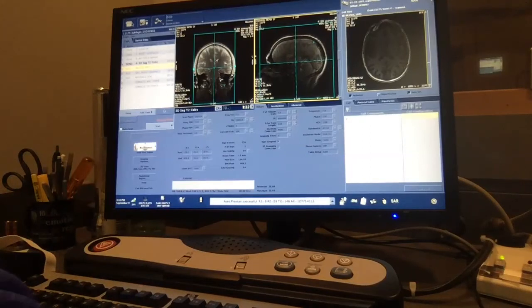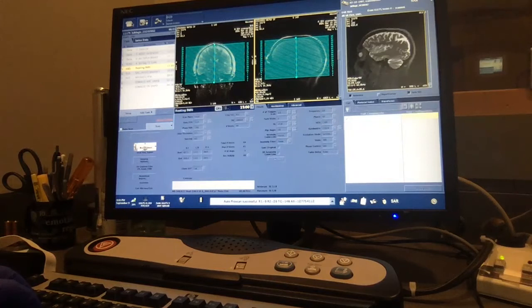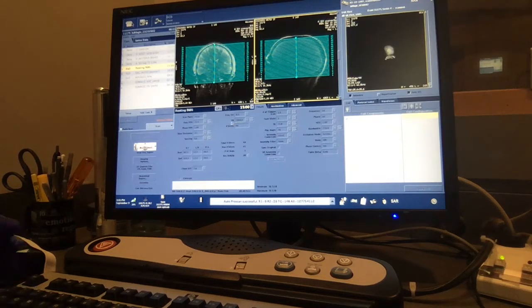Okay, the T2 weighted scan is finished up. I'm going to get this fMRI sequence that we use up and running. Again, you can see here on the console, we have a slightly smaller field of view at 22.4 centimeters, much larger slice thickness at 3.5 millimeters, and a TR that's fairly quick, 2000 milliseconds. So every 2 seconds, we're acquiring an image, and we're getting 40 slices.